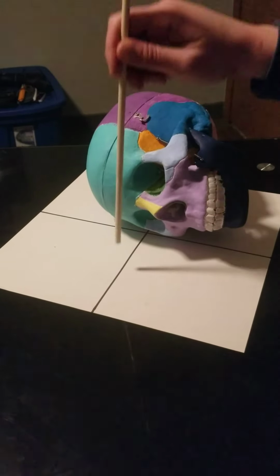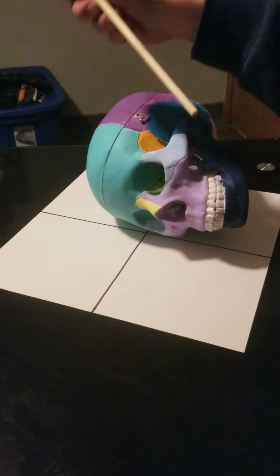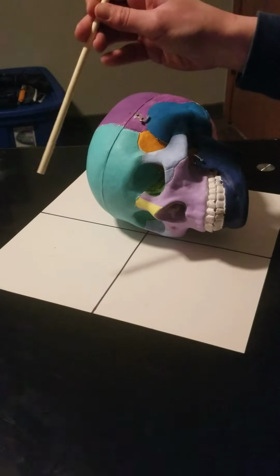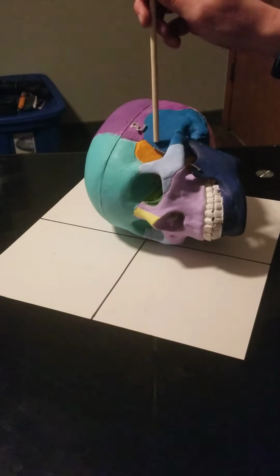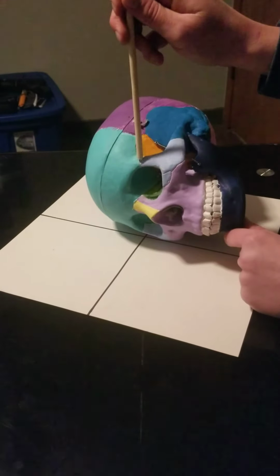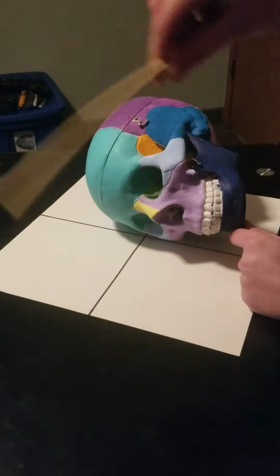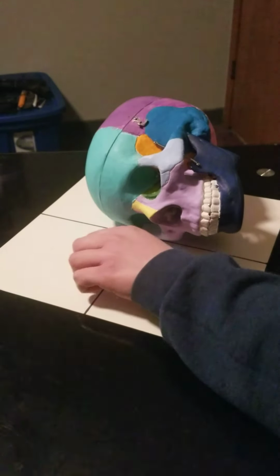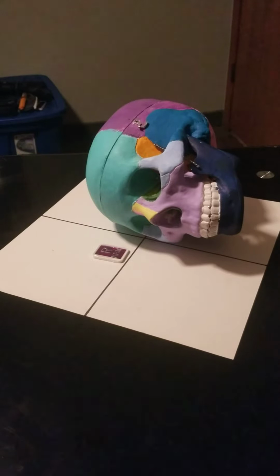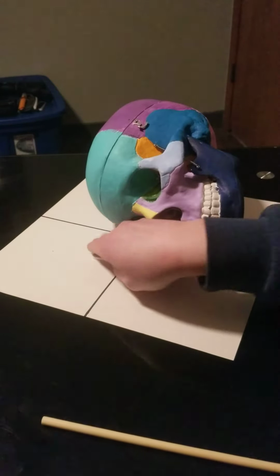I'd want my IPL perpendicular, my MSP parallel, and I'd want my central ray to enter through the outer canthus perpendicularly, like this, and then I would collimate down, include my marker, and then I'd instruct the patient to look straight ahead for the exposure, take the exposure, and let them know that they can relax.